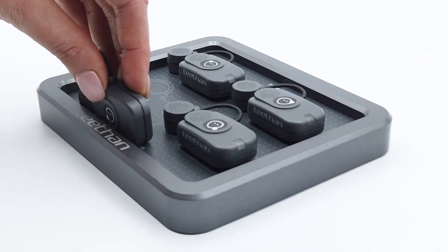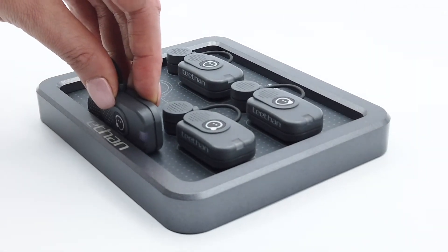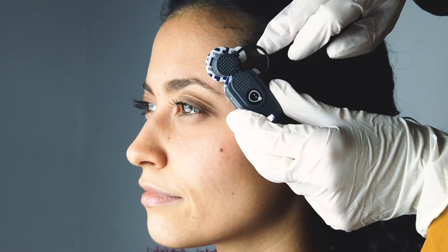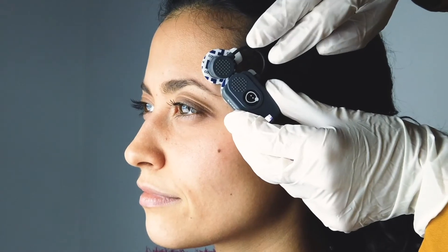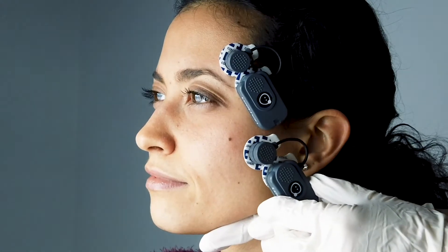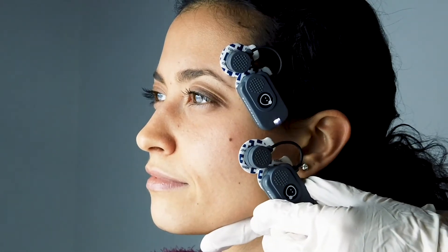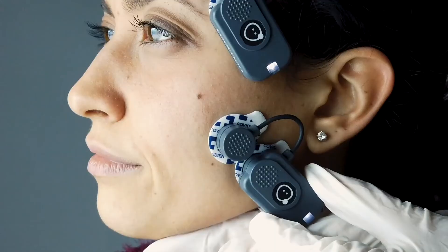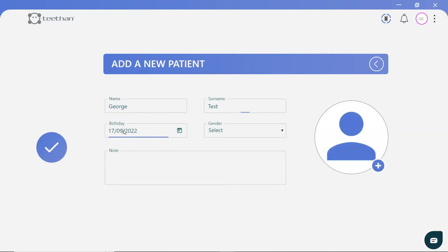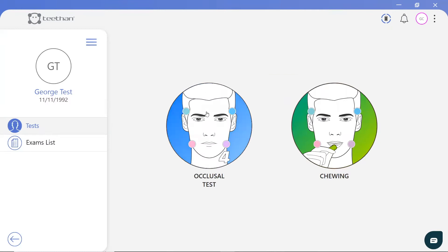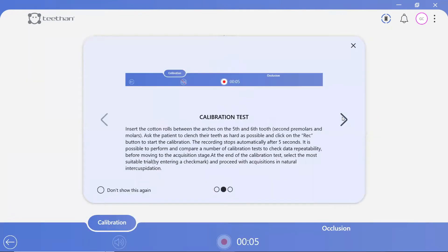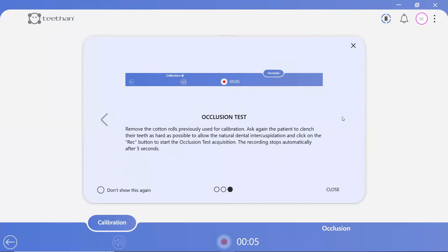Four small, wireless surface EMG probes are activated and applied to the patient's temporalis and masseter muscles, prior to a static and dynamic occlusion test. Simply add your patient to the database and click to begin the occlusal test. You do not need to be an EMG specialist, as you are clearly guided throughout each step of the assessment process and patient report.